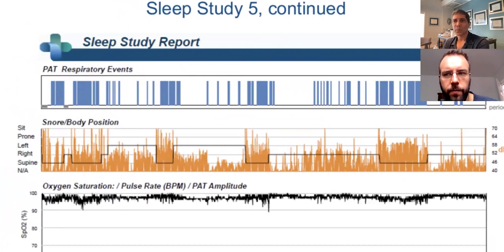You have to. Even someone in the hospital who's in a coma, you've got to move them every 2 hours. You have to move them, otherwise they're going to get a decubitus ulcer. So really, it's every 2 hours you have to move someone like that. I don't know the exact numbers, but it's somewhere along those lines. So if you think of it that way, you should at least have 4 movements during the night, minimum, right? So this isn't over the board, but a lot of snoring.